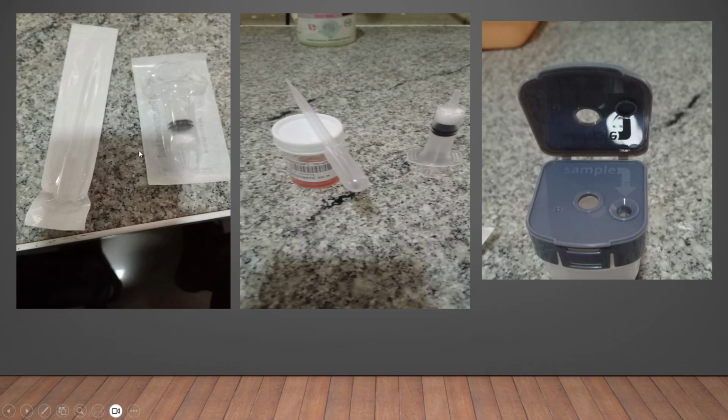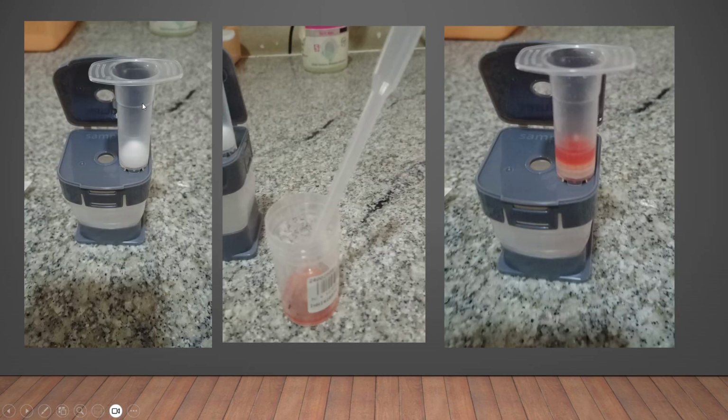Now you already have this instrument, so you open the cartridge holder. This is how it opens, and see, there are two holes here. The central hole is for the movement. Never ever use that. It is written properly that the sample has to be put here. So keep everything ready. Now open the syringe. Always open the syringe before you actually insert it into the cartridge. Once or twice I saw technicians who put the syringe here and then pull the piston out.